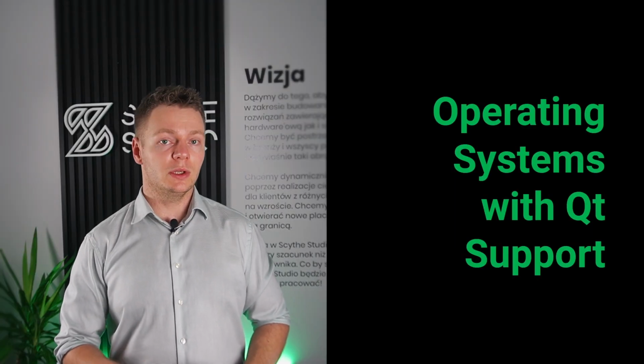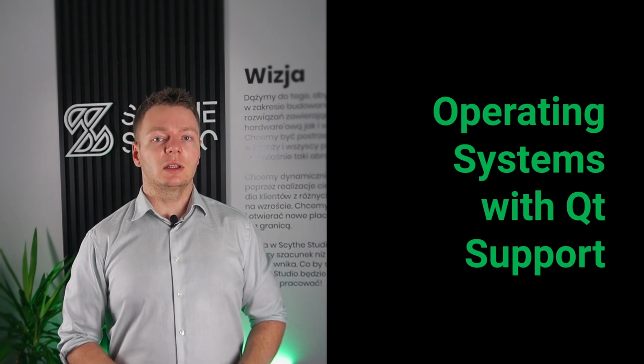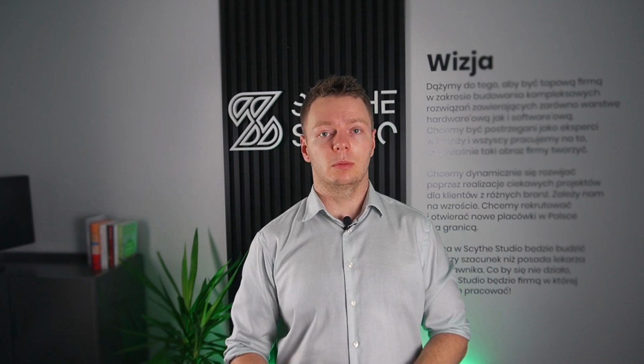So how does Qt support particular operating systems? As mentioned in the previous episode, Qt is cross-platform, right? So most of the operating systems that are available on the market can run software developed using Qt framework. Of course, as Qt is so powerful a framework, not all of the features are equally supported on all platforms. For example, microcontrollers don't have a GPU efficient enough to display complex graphical effects on high resolution, right? Therefore, support is different from platform to platform.